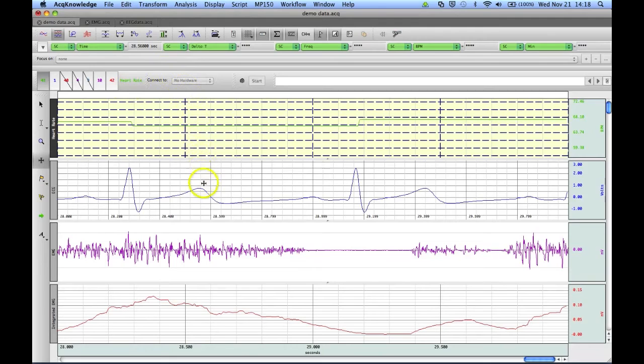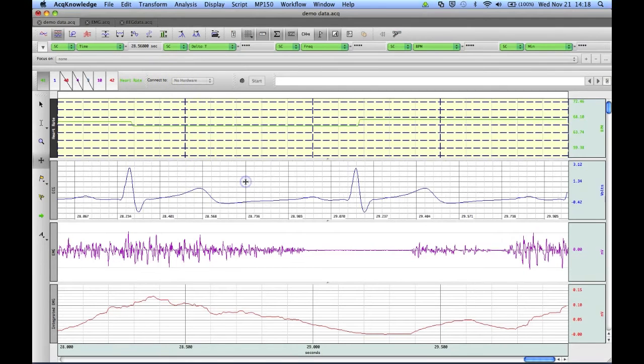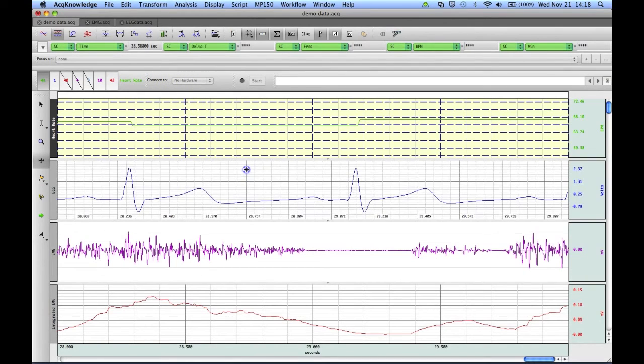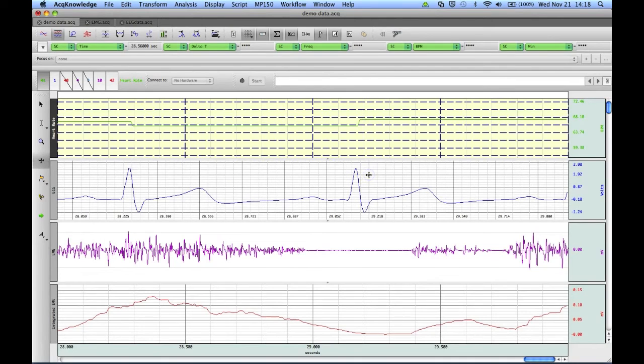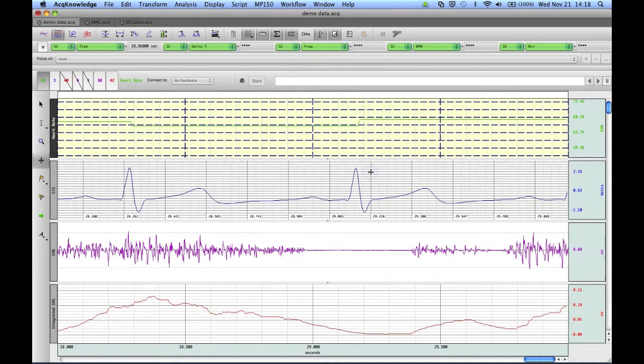And we can zoom in and change our grid division lines simply by clicking and dragging the Grid Tool.